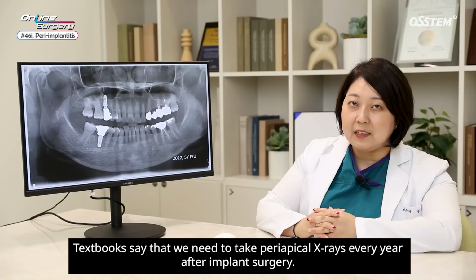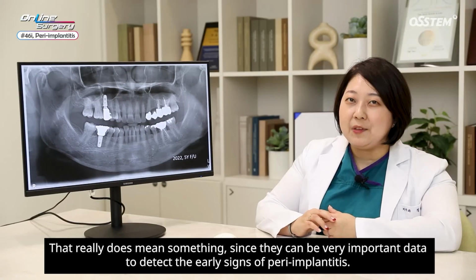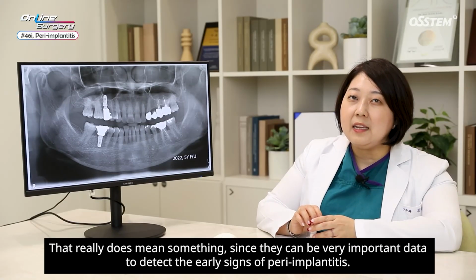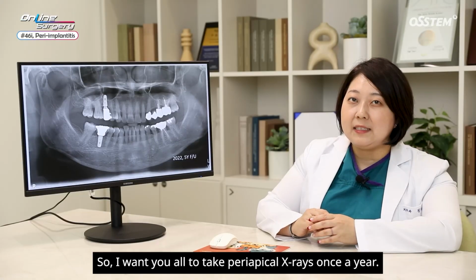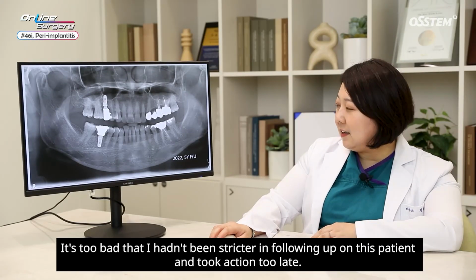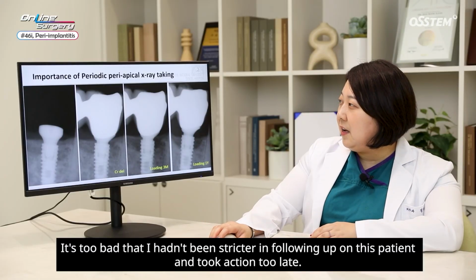Textbooks say that we need to take periapical x-rays every year after implant surgery. That really does mean something, since they can be very important data to detect the early signs of peri-implantitis. So, I want you all to take periapical x-rays once a year. It's too bad that I hadn't been stricter in following up on this patient and took action too late.